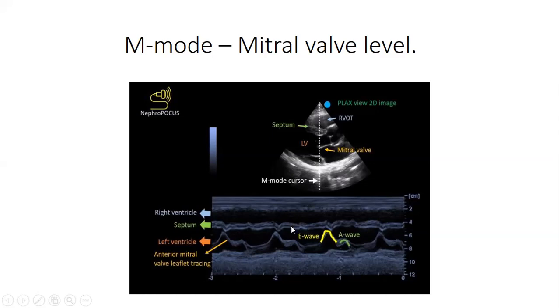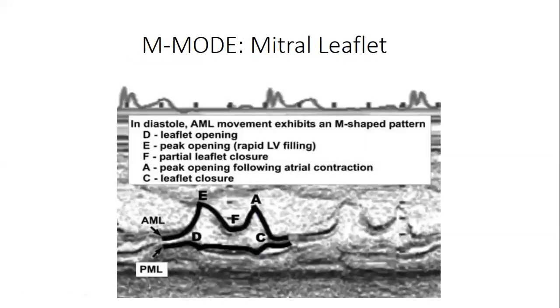You measure from there to there, and the septum is measured from there up to there. Normal should be 6 millimeters to 11 millimeters. That is from here to there. We'll discuss these measurements, don't worry. And then from there, you have to measure up to here as your LV internal diameter. And then the posterior wall, you measure it from there up to there. Don't include the pericardium. So there is a measurement, we'll assess how we measure this. So I think that's all about this one. I hope we've exhausted this one.